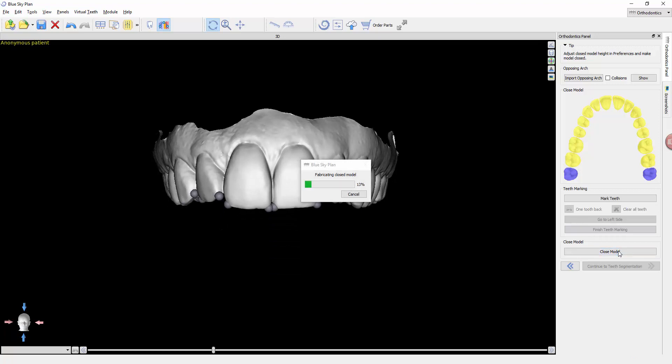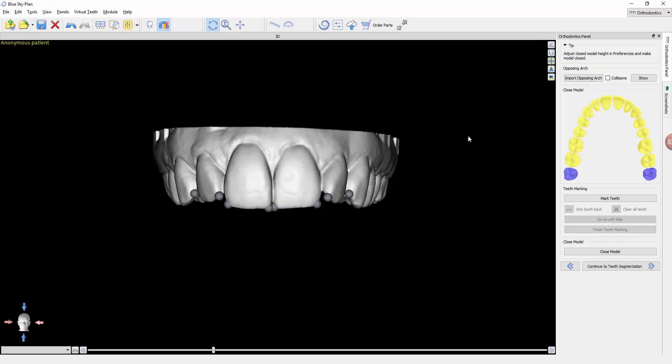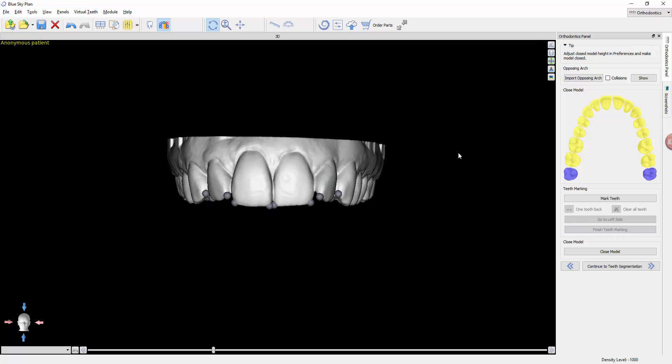I'm going to click close model. This is going to give us a base. That's one of the parameters in the tool setting of the preferences that I showed earlier in the previous module, where you can determine how tall you would like the model to be, how tall the base should be after it closes it. So here is our model.